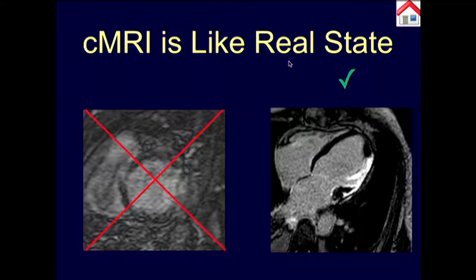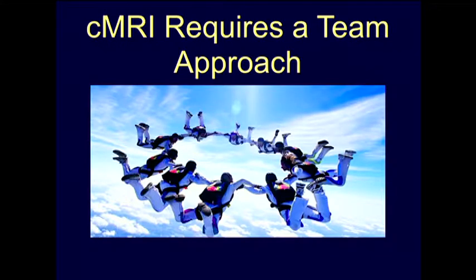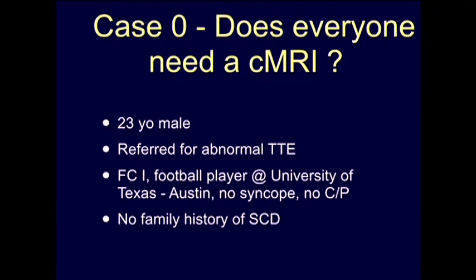Sometimes we are not perfect. They don't come out well. I discuss with Dr. Roa here because I call back the patients and re-inject with gadolinium, because if I don't obtain this quality of image, I'm not doing a good job. It's always teamwork that we need.